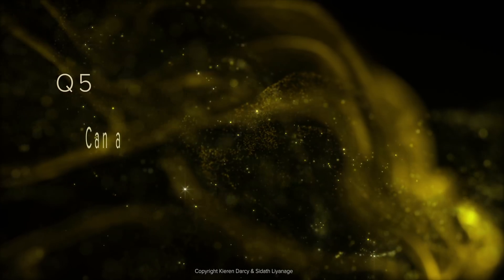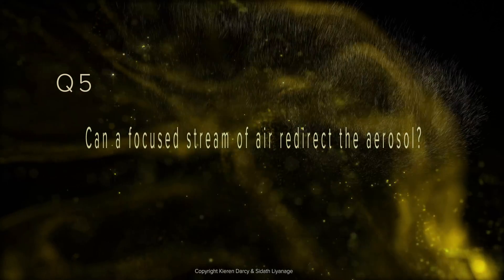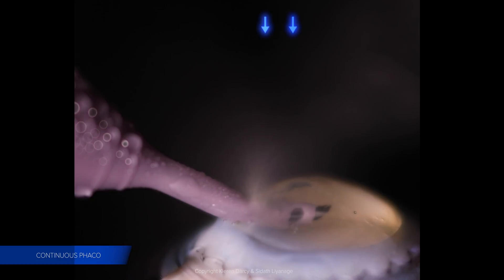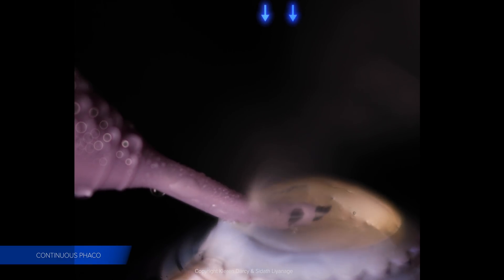Question 5: Can a focused stream of air redirect the aerosol? The stream of air successfully redirects the aerosol away from the surgeon. The effect of dissipating the aerosol into the theatre would need determining. Any clinical device would require filtration to prevent an increased risk of infection.